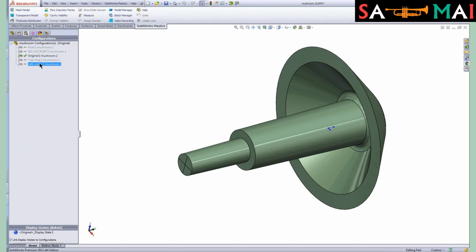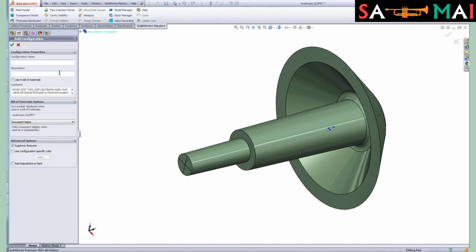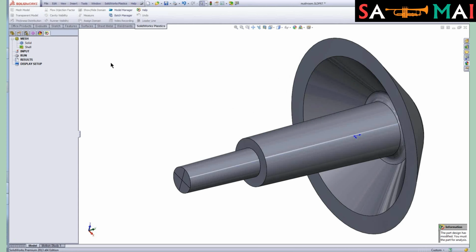I've turned on an option so that Plastics recognizes I have multiple configurations in a part. So let's just go ahead and add a new configuration. We'll call this our webinar model. And I get a warning that I need to reload the Plastics project. That's completely expected. That's basically telling me, hey, you've changed your model. You need to do something with it. So let's go ahead and start through this.